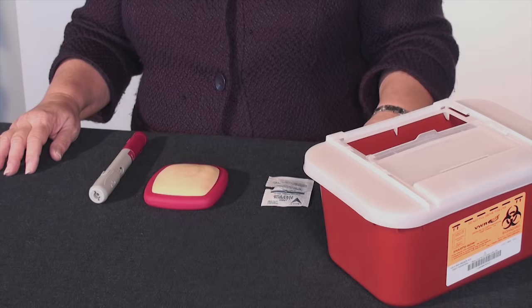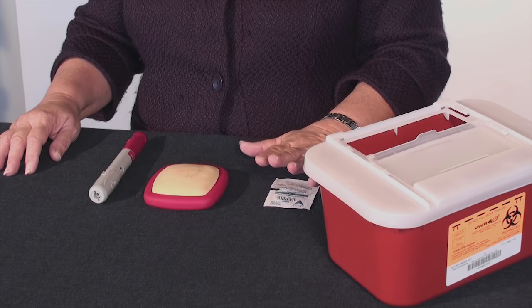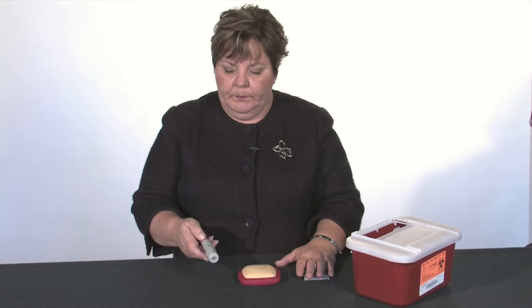We're going to learn how to inject Humira. First you're going to gather your supplies. You'll need an alcohol wipe, or you can use a bottle of rubbing alcohol with a cotton ball, and you'll need your syringe.